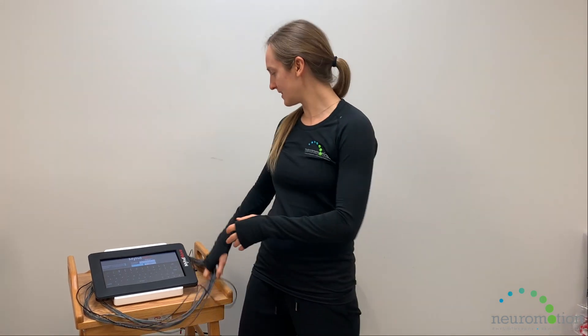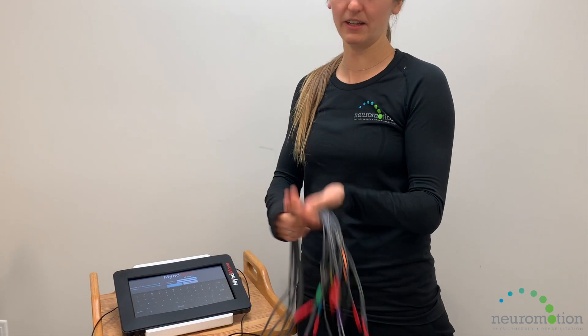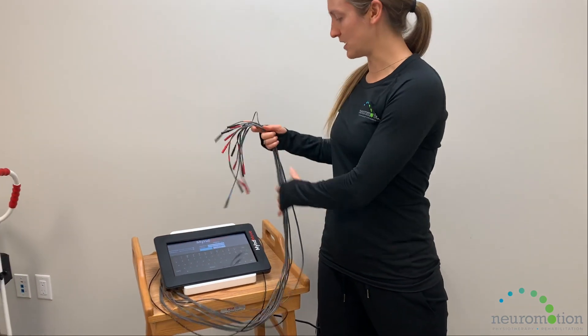Mindmove is a functional electrical stimulation unit. What makes it unique from other e-stim units is that there are eight channels — you'll see there's eight cables here — that you can connect to a client, and you can put up to 16 electrodes on each arm. This makes it unique because it works into a functional reaching pattern rather than just stimulating one muscle at a time.